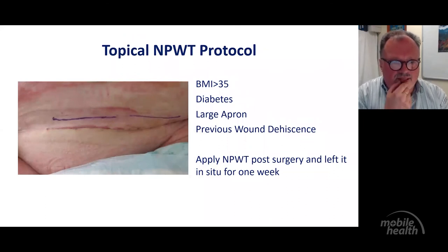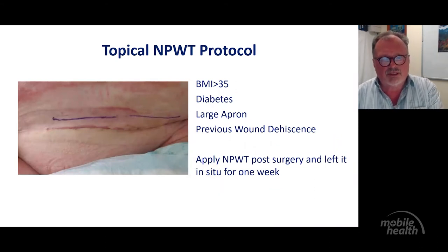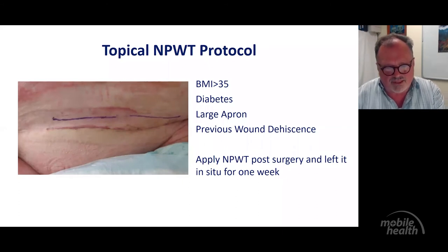And the wound healed very, very nicely, as you can see here, a week after the dressing was taken off. So pretty much in obstetrics, we have this in place. We don't use it a whole lot for orthopedics and so forth. The jury is still out if we want to introduce it there.